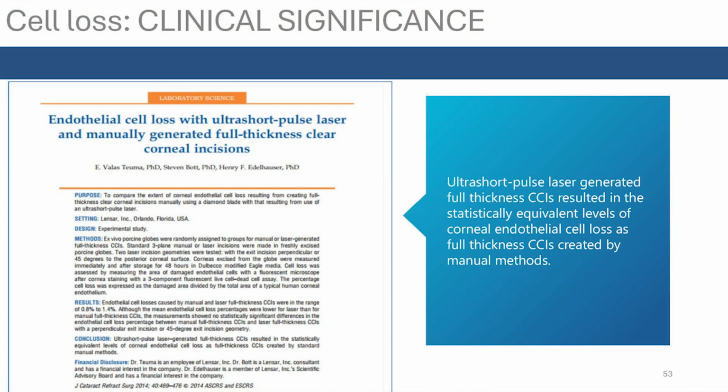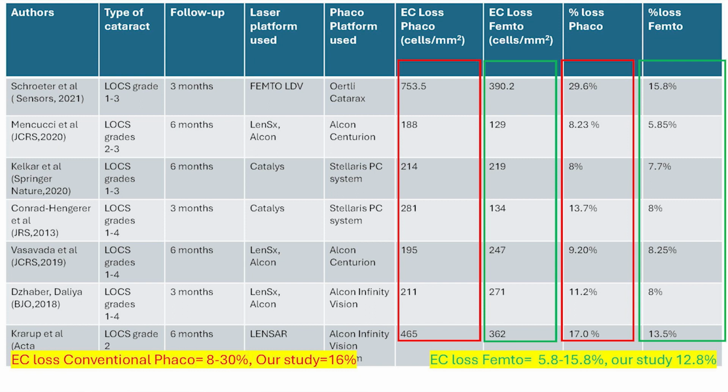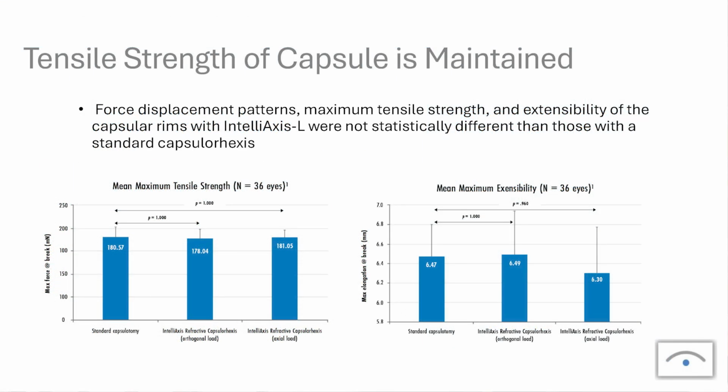So I think what we have is really just a confluence of innovation with technology, with marginal improvement, because we've always done quite well, and better results because of all of those things that we pay attention to. It's each step of the way we need to make good decisions based on good data. We talked a little bit earlier about endothelial cell loss being mitigated. That makes sense. The safety, because of the fact that we have a better, more robust capsulotomy. So can we do a better job? The answer is yes. Are we doing a better job? The answer is yes. Your patients will be offered this.